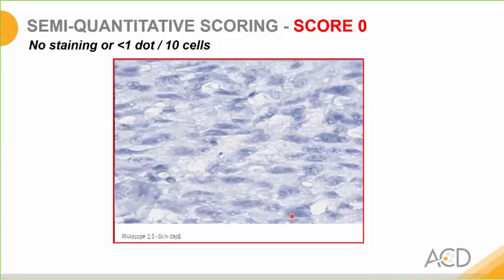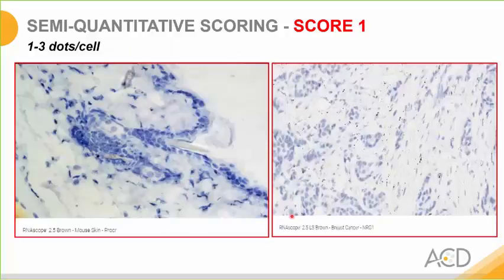A representative example of a semi-quantitative score of 0 for this scoring system that we just went over is shown in this panel with clearly absent dots in this photomicrograph. These panels show a score of 1, with most cells containing between 1 and 3 dots. The dots are a little bit difficult to visualize because of the darker hematoxylin stain on the left, but there is approximately one dot per cell visualized. It's a little bit easier to see in the cells in the right-hand panel, where you clearly see that it's in the range of 1 to 2 dots per cell.